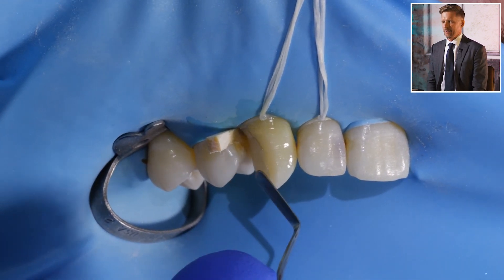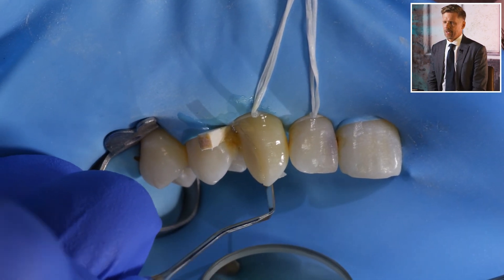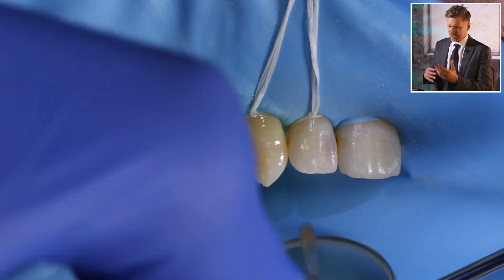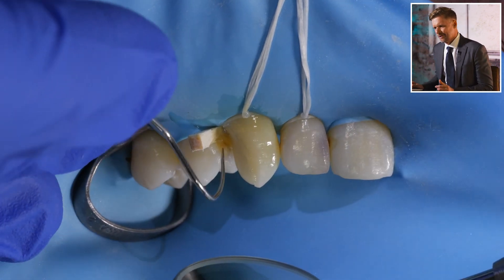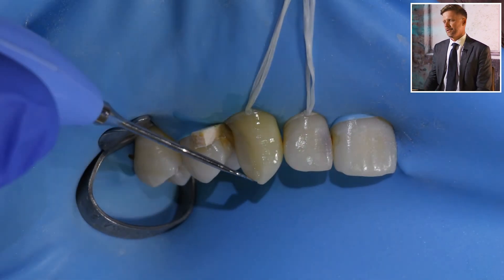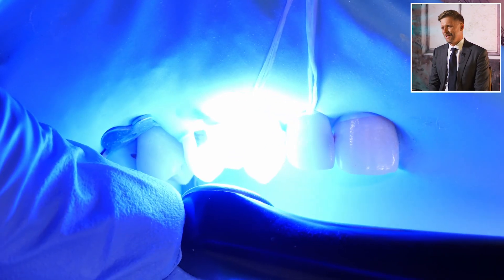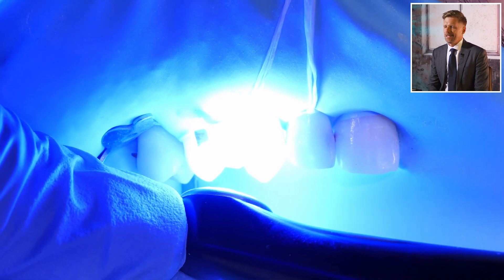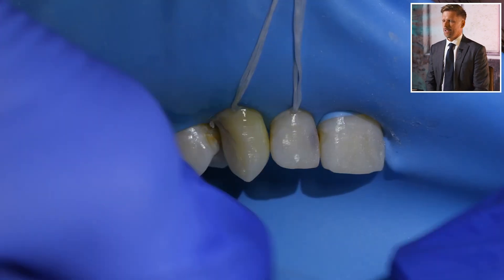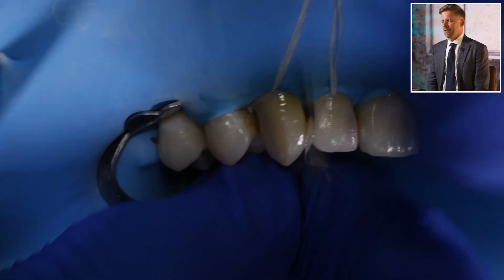The opaque resin covers that black dentine, so now when I put the dentine shade in, it doesn't have that super gray look anymore. We're making it the size of the dentine portion of the tooth — not full size, not at the margins — because the opaque material at the margins would show through as a line. We're leaving space for a whole enamel layer. We'll cure that dentine layer, then pull out the matrix. There'll be some roughness from the wooden wedge.